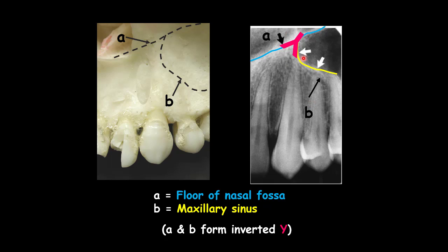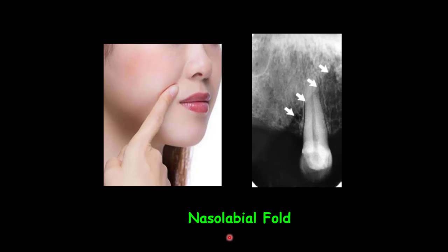This inverted Y is a useful landmark demonstrating the position on a periapical radiograph of the maxilla. The nasal labial fold is an opaque radiopaque line on periapical radiographs of the canine and premolar region. This radiopaque line appears because thick cheek tissue is superimposed on the teeth and the alveolar process. As aging increases the creasing of the skin, the nasal labial fold starts getting deeper and the fold becomes more evident in the periapical radiograph.